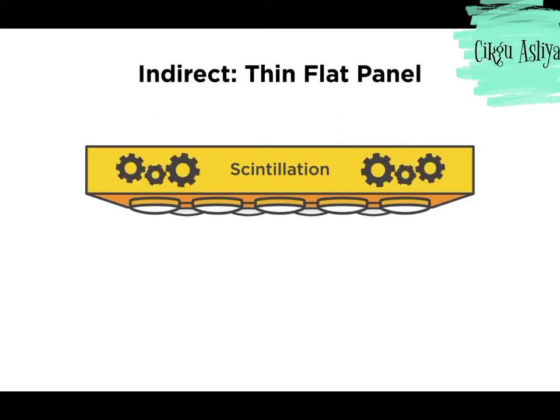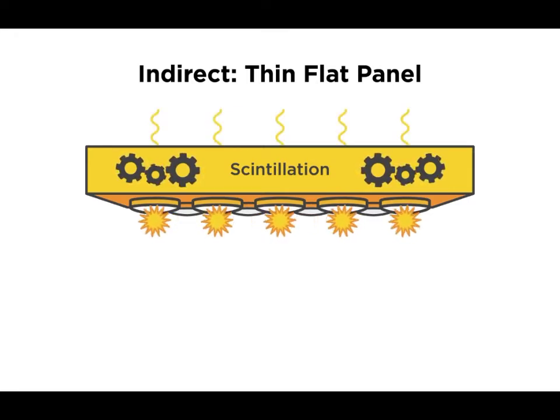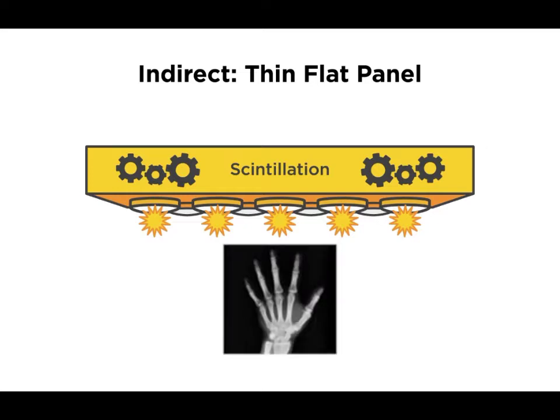into light photons. A scintillation is nothing more than a burst of light, which is why this layer is called the scintillation layer. Each photon that strikes the scintillation layer creates a small burst of light energy. Unfortunately, one downfall of using a scintillation layer is that it produces light isotropically, or in all directions. The isotropic nature of this layer thus acts to decrease spatial resolution, since the converted light photons are of a greater size than the incoming incident X-ray photons.